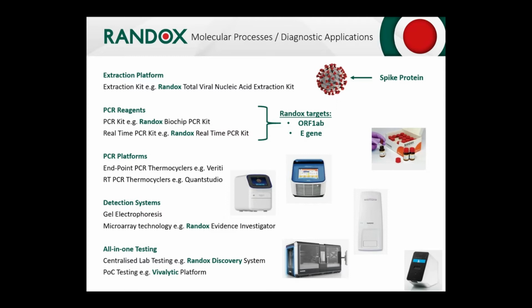It's got the capability of undertaking a step called DNA hybridization and conjugation, which can result in the qualitative detection of the coronavirus gene targets by producing a chemiluminescent signal, which is spotted under a special type of camera within the Evidence Investigator platform. And alternatively, smaller labs may use other technologies such as gel electrophoresis, capillary sequencing, and then some very advanced laboratories will also use some form of viral genome sequencing, such as next generation sequencing as well.